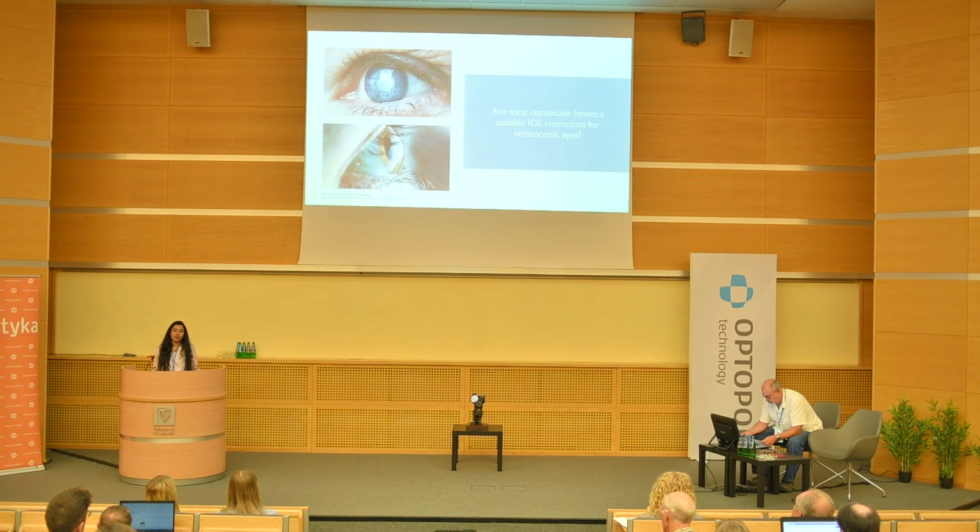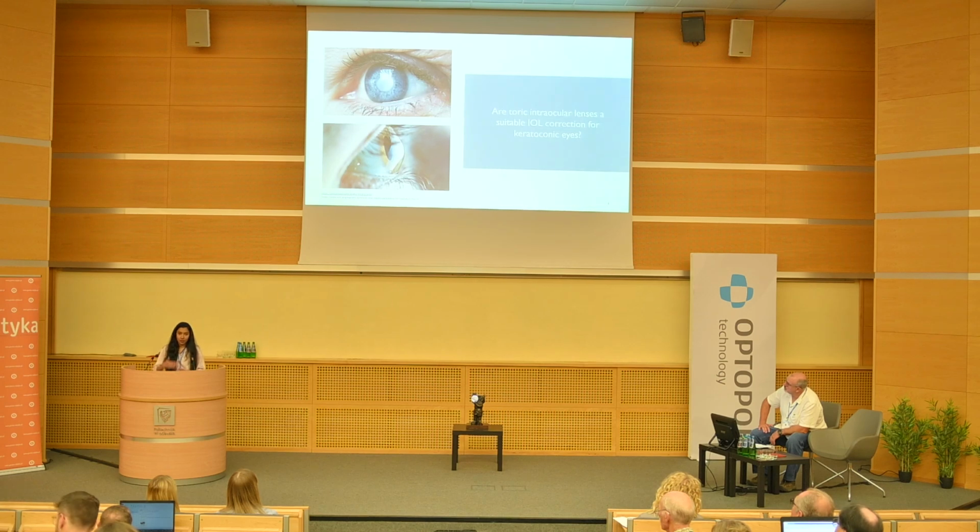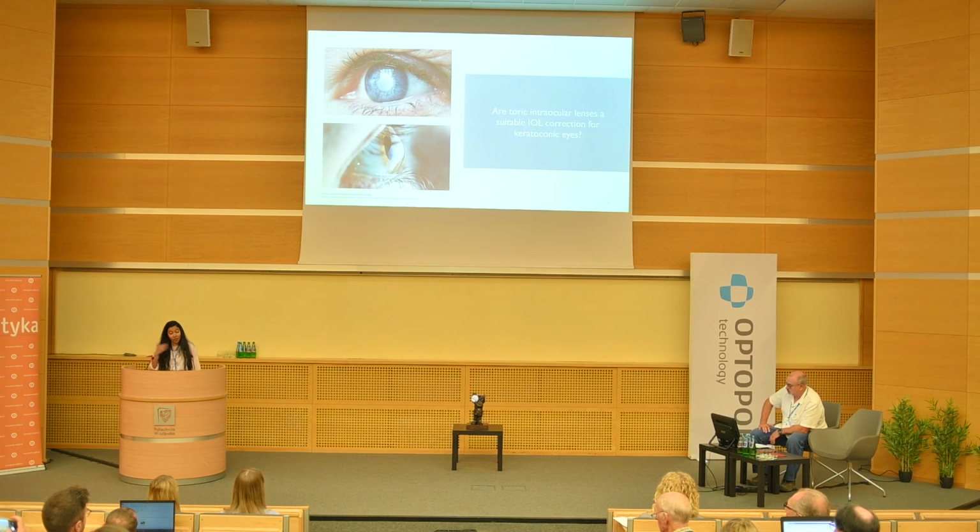This whole study is done in a virtual environment, and different correction strategies for IOL corrections are going to be tried out. Because in a real-life case, as always with surgery, there's only one chance, right? One correction. But here, since it's a virtual case, different IOL corrections and contact lens corrections combined with IOL corrections are tested in keratoconic eyes, and we can see which is the best-case scenario.